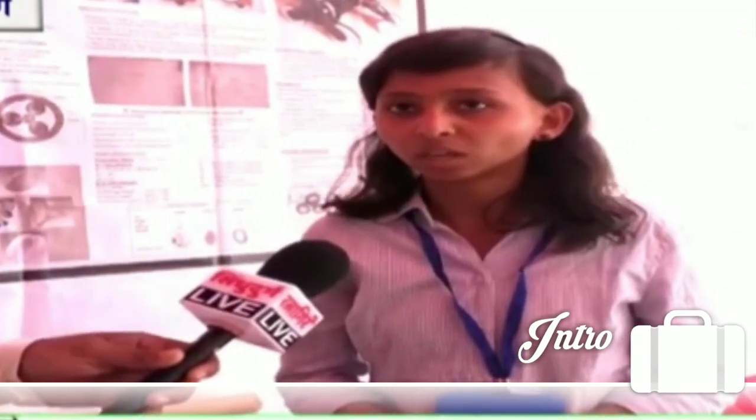I am at the engineering college in Badrara. We have a project called Stair Class Climbing Wheelchair. Our main motive is to create a new concept, as it is not currently possible in society.